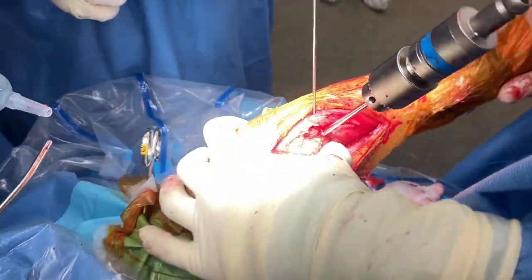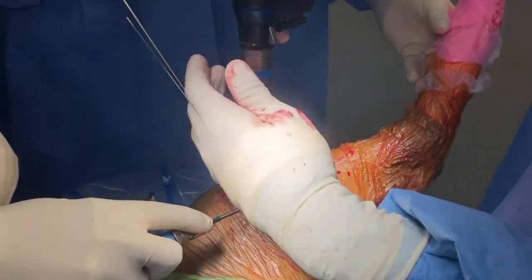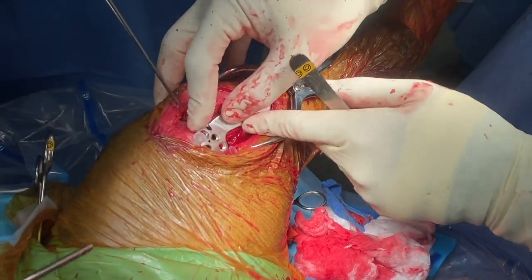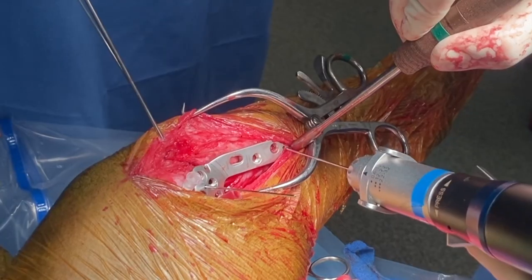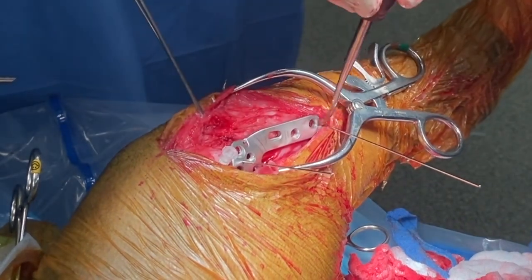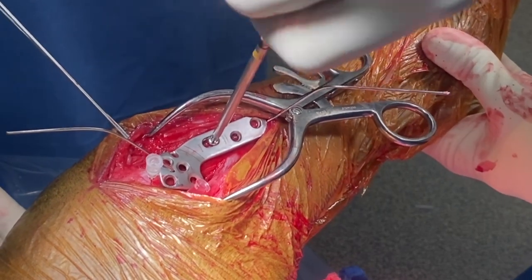Limb alignment is assessed in both flexion and extension and the tibial compression test can also be performed. The rotation pin is removed and the joint line is again identified with a needle. Certain plates can be temporarily secured with Kirschner wires. The plate should be well centered proximally and aligned with the bone distally. Here we are checking the position of the plate relative to the borders of the tibia both distally and proximally. Screw placement order is not critical but in general cortical screws should be placed before locking screws within a bone segment.